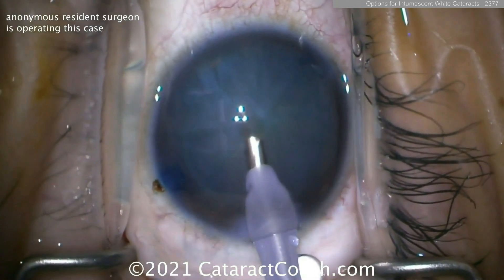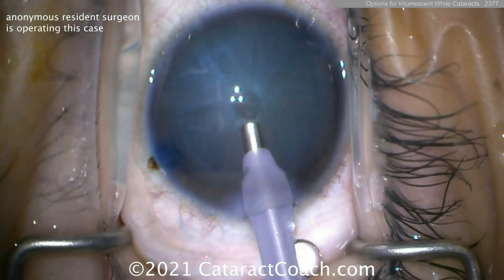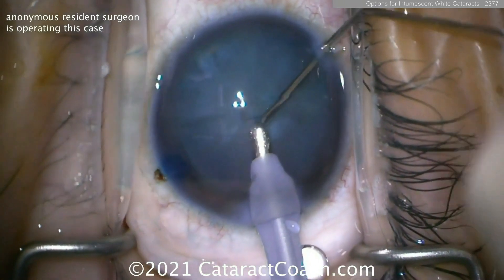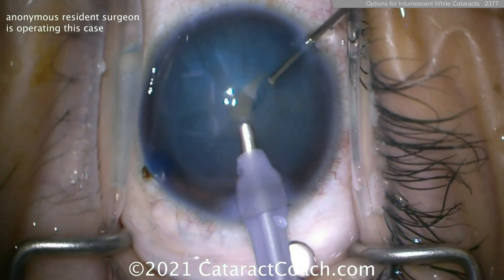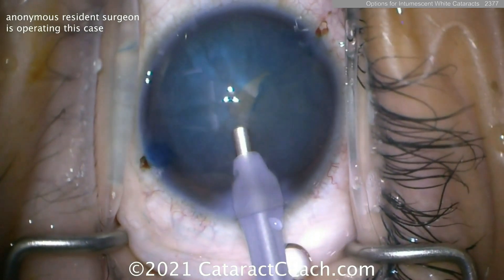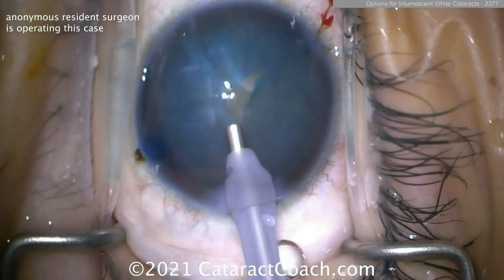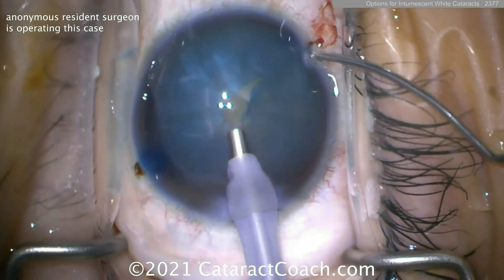You can also use the phaco probe to puncture the anterior lens capsule if it's a very highly pressurized capsular bag with intumescent lens milk filling the bag. Using the phaco probe to puncture a single hole there, keep the probe in the eye with high infusion pressure — don't let the AC collapse. Now through the side port you can use your cystitome or other small forceps.